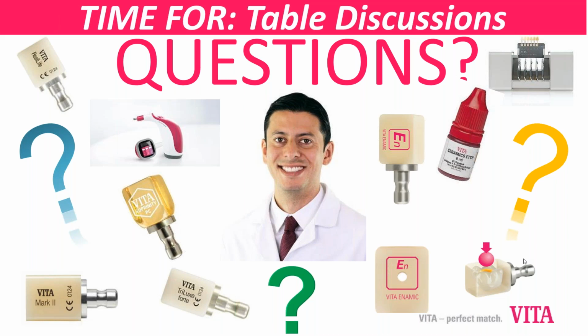Feldspathics are great, but rely on the condition of the abutment tooth. So I would use the feldspathics for probably younger patients, where once you prepped, the color of the stump is more ideal or not so far from what you're looking to get.